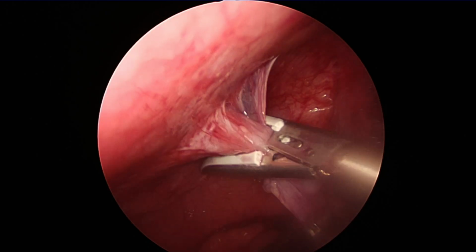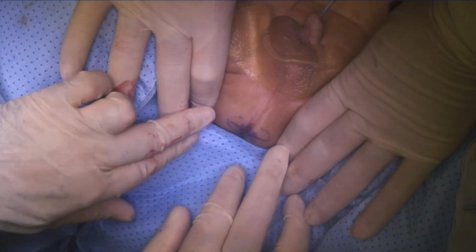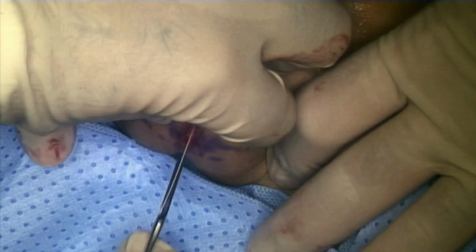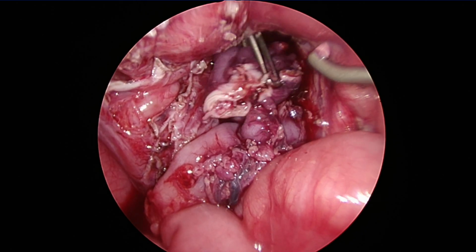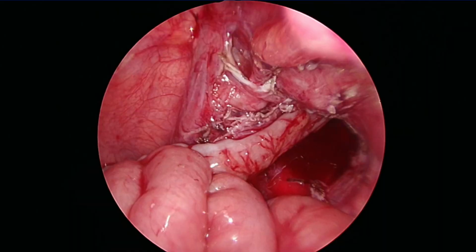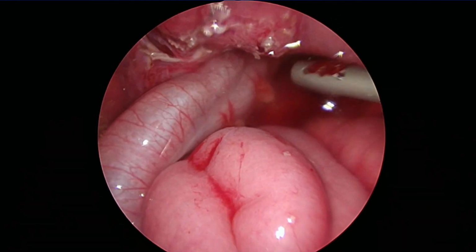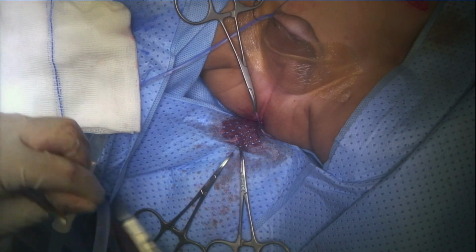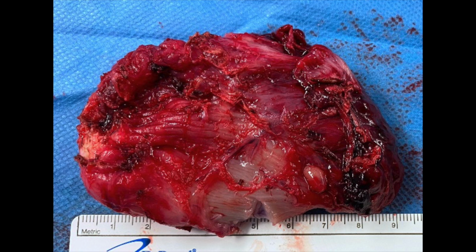The colostomy was then undone and then the anal incision was made at the level of the identified sphincters and it was gradually dilated with a Hager's dilator. The pouch colon was removed and the normal colon was pulled through the newly constructed anal area. The cavity was thoroughly washed with normal saline to remove any infected material. Part of the colon did not look healthy, therefore that was excised and a coloanal anastomosis was performed using interrupted 5-0 Vicryl sutures. As you may notice, the pouch colon was significantly thickened due to recurrent infections and obstruction.